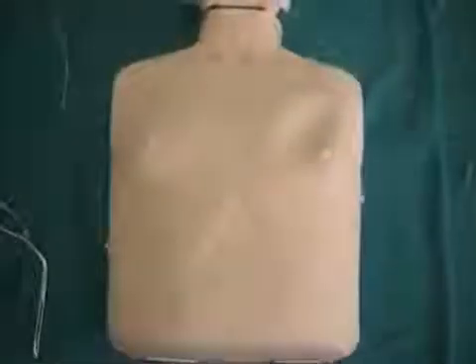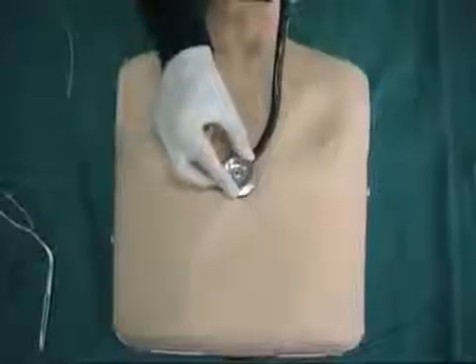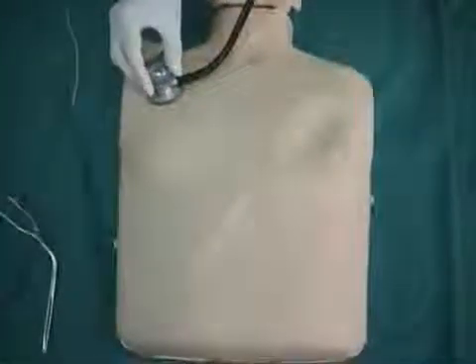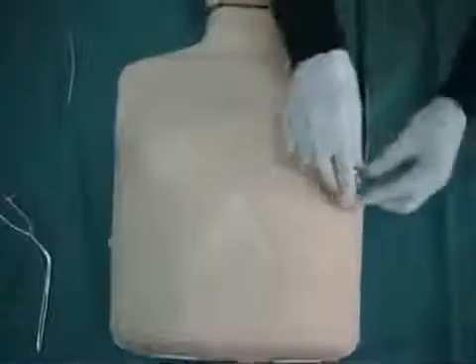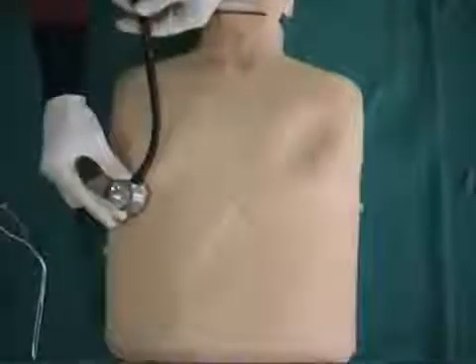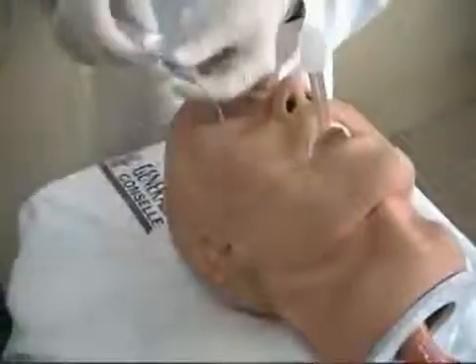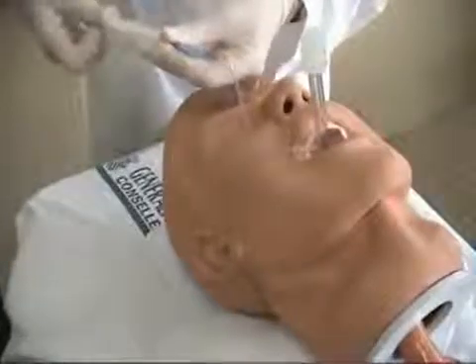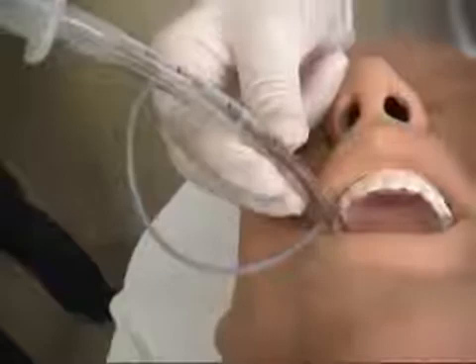We should assess for an esophageal endotracheal tube placement by auscultating over the stomach during the ventilation. Auscultate both sides of the chest in the mid-axillary line to assess for equal bilateral air movement. If breath sounds are diminished or absent on the left side, it is suggestive of right mainstem intubation. So, we will need to deflate the balloon and gradually withdraw the endotracheal tube until symmetrical sounds are auscultated.